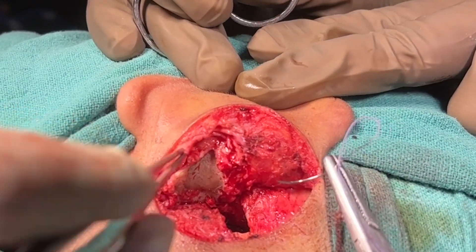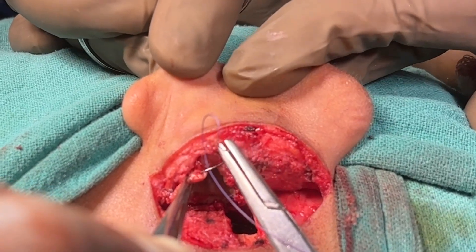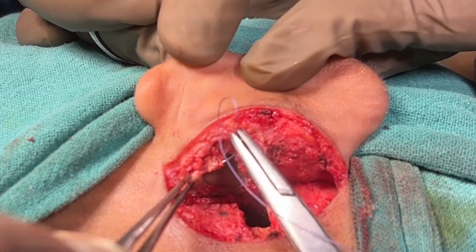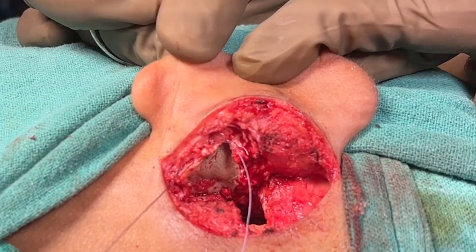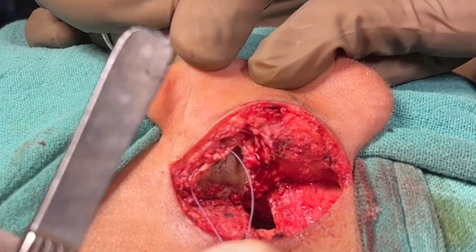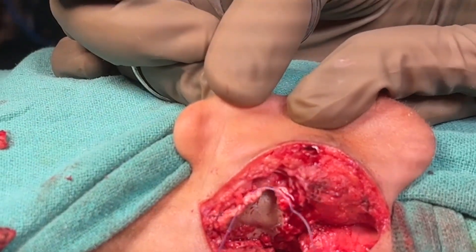This patient was a case of left-sided unsafe chronic otitis media with a large cholesteatoma sac filling the antrum. The surgery has been performed and in this video I am just showing the technique of meatoplasty. After suturing the inferior flap, we have to give a few more supporting sutures of the EAC skin to the surrounding tissue.